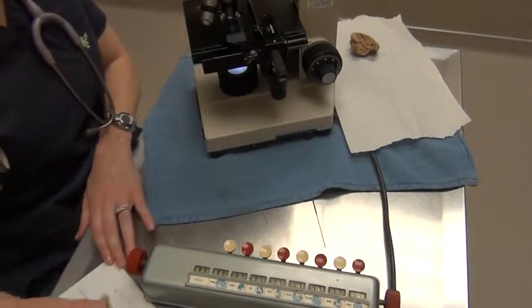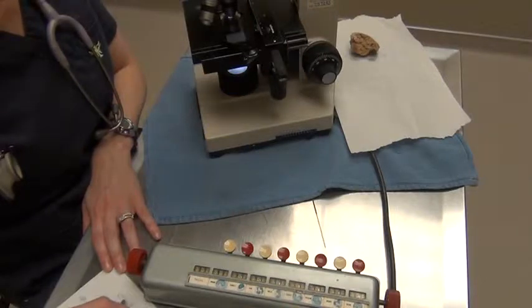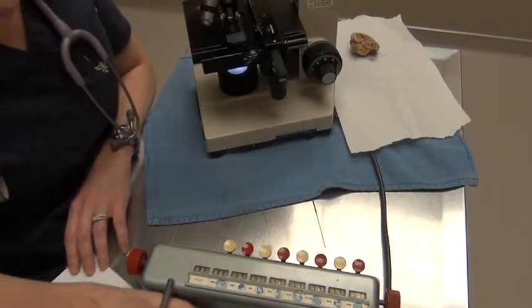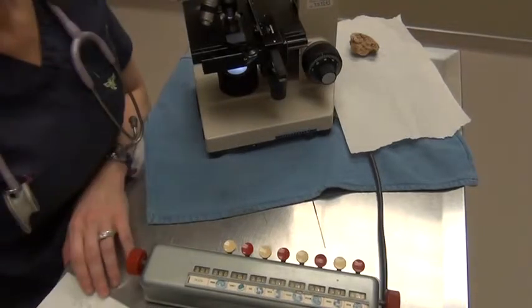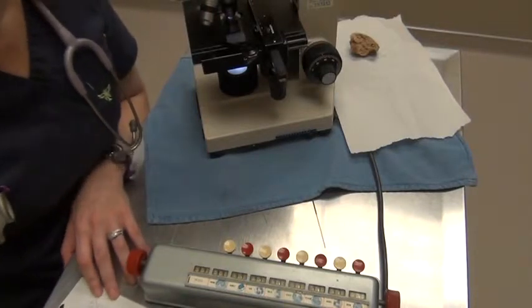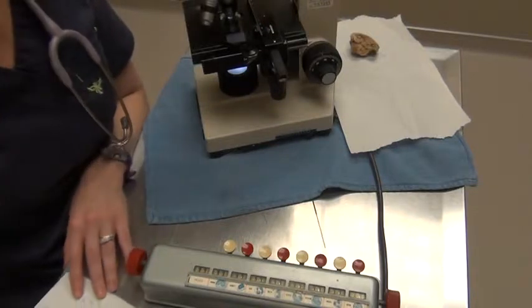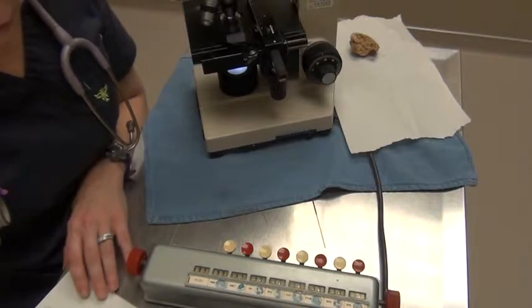Okay, so I'm just going to make sure I have 10 fields here. I'm going to add all these numbers up, and I'm going to divide it by 10. So we're going to go ahead and add these up. Okay, so the number that I came up with was 43, so I would divide 43 by 10, which would come up to 4.3, and that's platelets per oil immersion field.